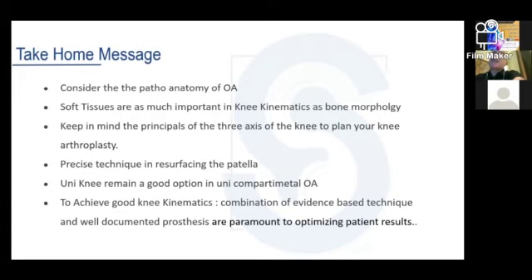In a very severe valgus knee, the knee is initially not normal, because there is a hypoplastic lateral condyle, and there is retraction, shrinking of the posterolateral corner, and that's why to balance the soft tissue, we are sometimes obliged to use the pie crusting technique or some techniques to modify the soft tissue a little bit to give a good alignment of the knee.